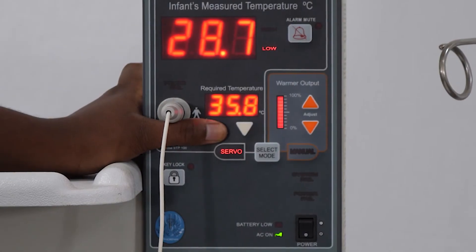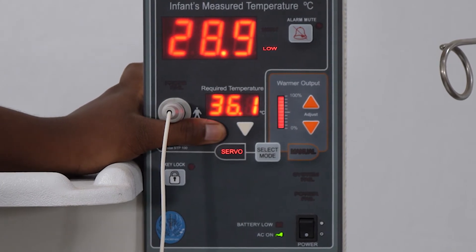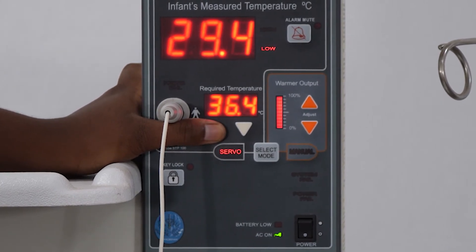In servo mode, set the required temperature or target temperature to 36.5 degrees using the arrows.